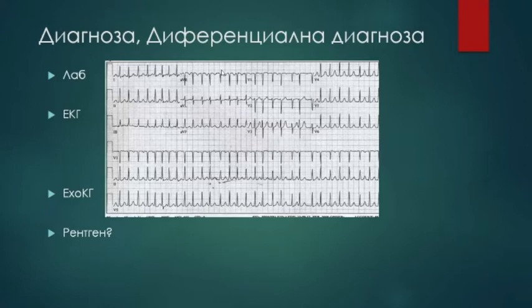Someone of you said that we have to check electrolytes as well, because electrolyte disturbances can be a reason for rhythm and conduction disturbances. Atrial fibrillation is one of them. So definitely electrolyte and troponin levels, if you are seeing ST segment deviation.